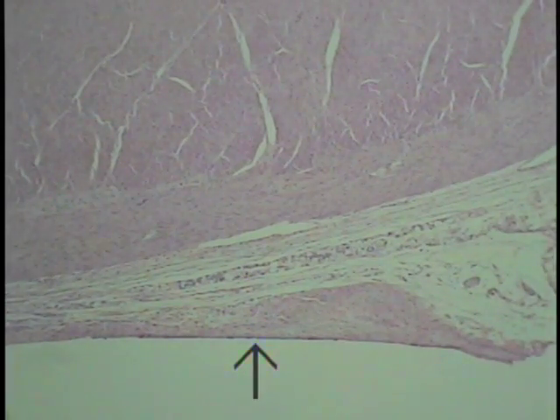And then it should be surfaced, though it's pulled off a little bit, by a serosa limiting its exterior boundary. And that is shown a little bit better even at this very low magnification, this connective tissue being limited by a simple squamous mesothelium. So these are the three layers, or strata, of the pyloric region of the stomach.